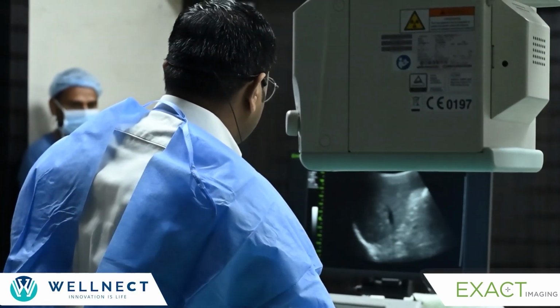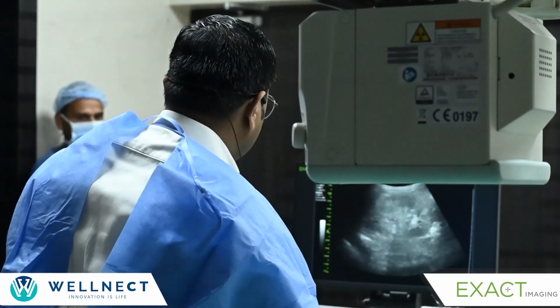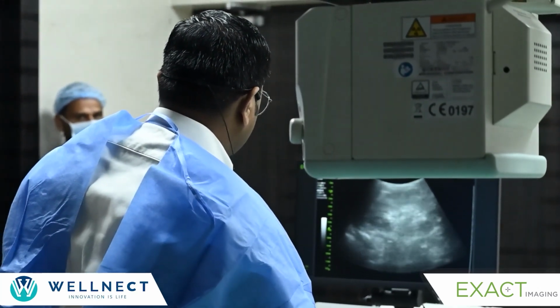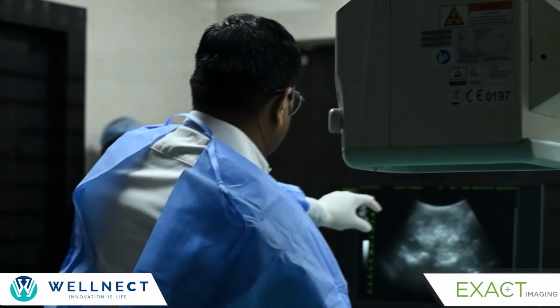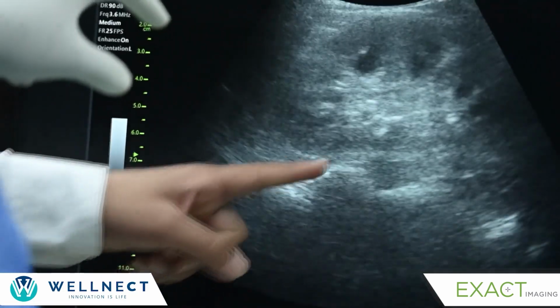And how do you compare it? This is your liver. So you have to compare with that liver, and the kidney is either isoechoic or hypoechoic. And you see the pelvicalyceal system is not dilated. It is giving you so much detail. Can you see the pulsation of the vessels in that kidney? So it gives a very good detailing about the kidney.